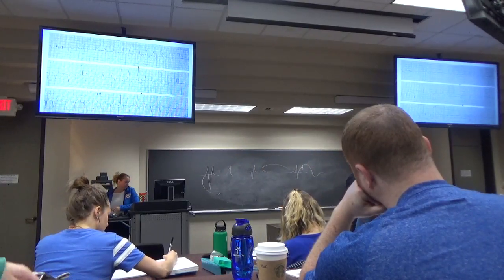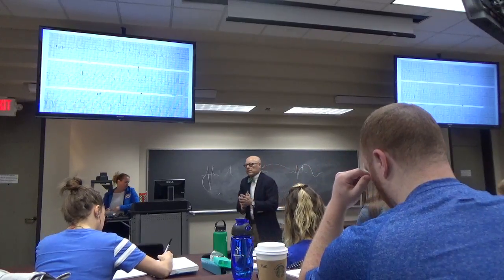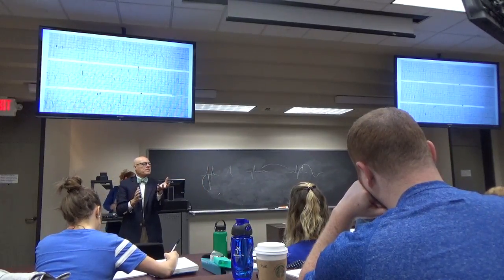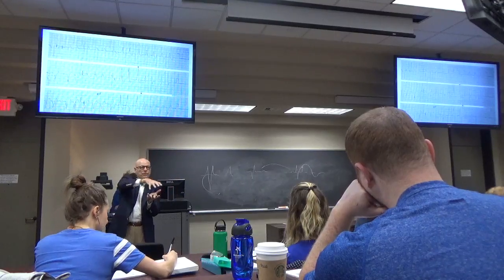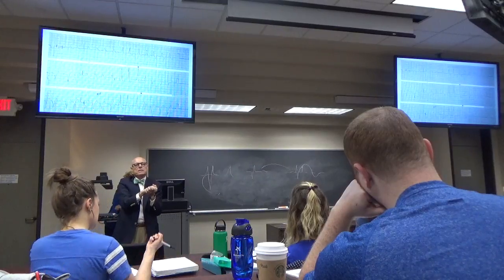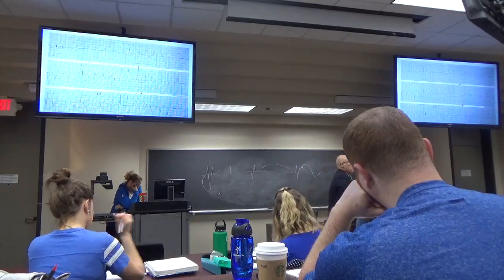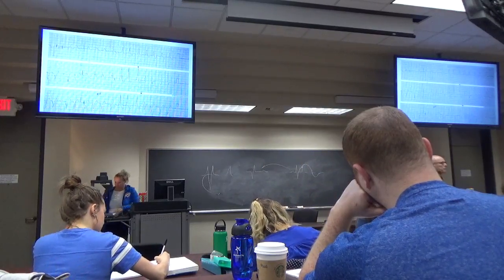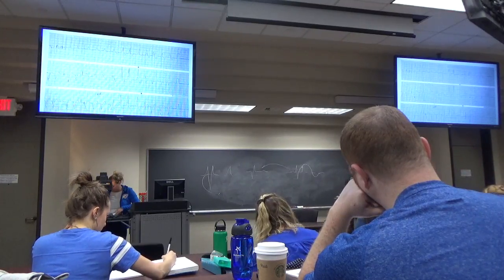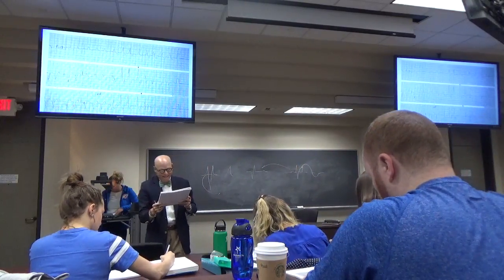And there should be transition around V3, V4. And then there should be more R, a little less S. That's all because the left ventricle, which is most of the electrical force, is sitting laterally and behind, with the right ventricle sitting up on the top. Does that make sense? So we have lack of posterior forces. We either have a lack of posterior forces or too many anterior forces. The most common thing with this kind of pattern is a posterior lack. Okay. Do we have Q waves?